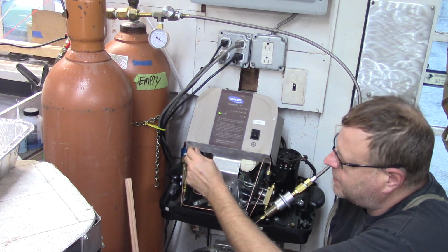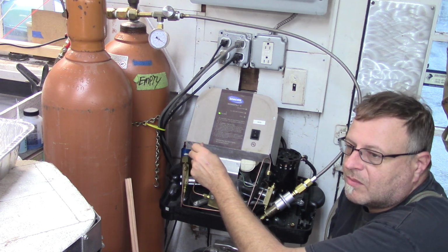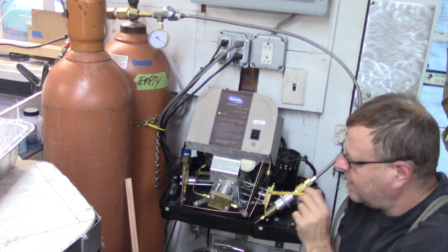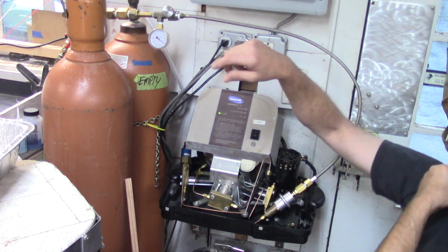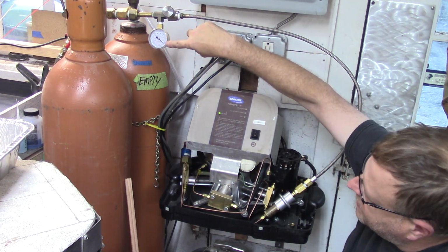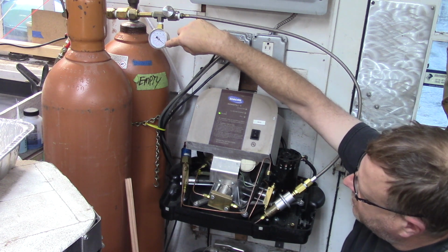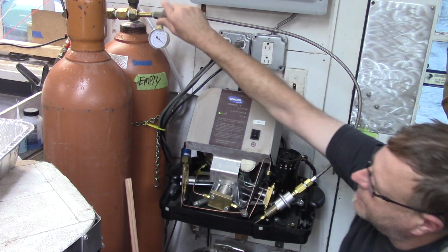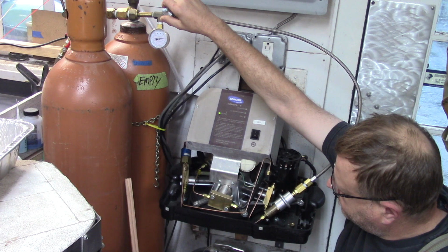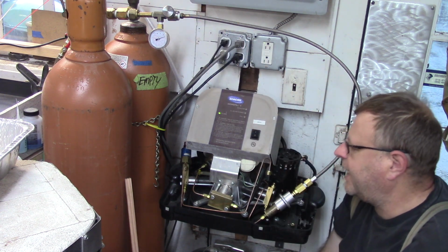If this was to somehow be damaged, there's a blowout. There it goes. You can hear it laboring and then shuts off. That's the out of balanceness. I've reached 1000 psi. And as soon as you release the pressure, it just starts running again.